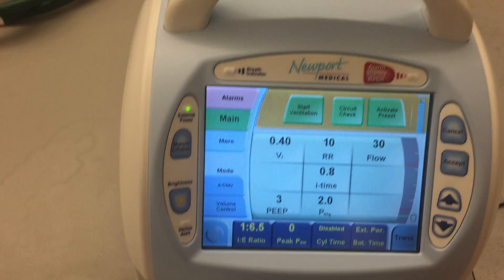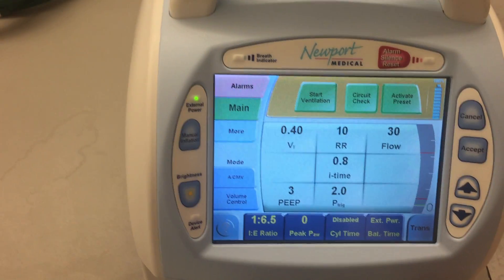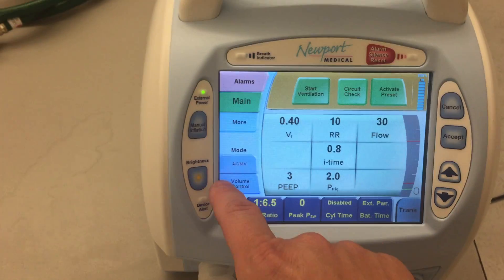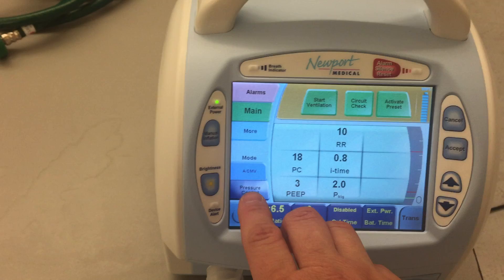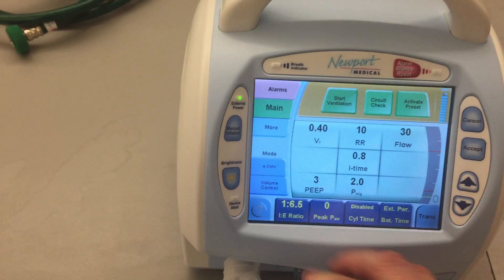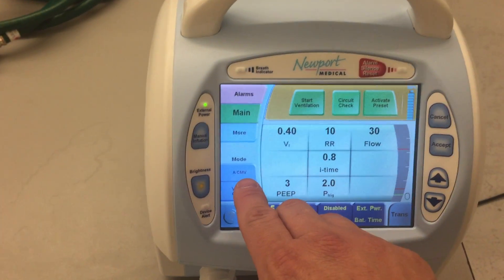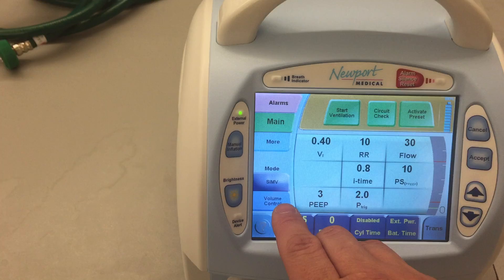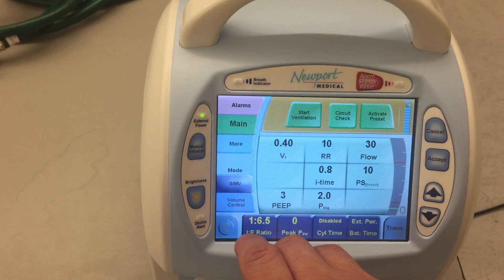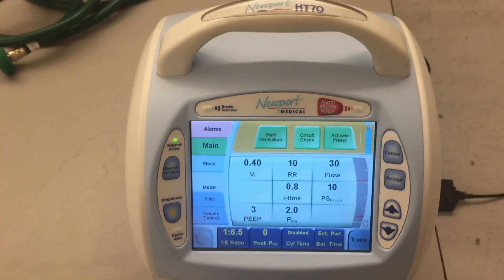So my basic setup is as follows. I have down here Mode, and then I have these buttons on the press screen as well. What I want to do is set this up in Volume Control and SIMV for my mode. So here you can see I have Volume Control and Pressure Control. We're going to put this in Volume Control and hit Accept. Then here under Mode, I have Assist Control slash CMV — Control Mechanical Ventilation — or I have SIMV, or Spontaneous. I'm going to put this into SIMV, Synchronized Intermittent Mandatory Ventilation, and hit Accept.